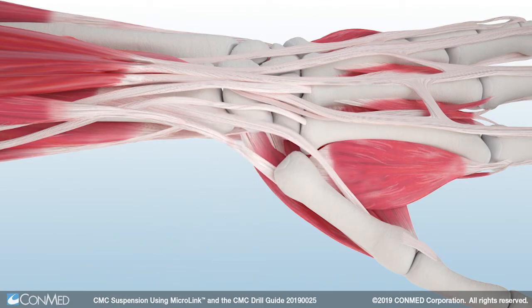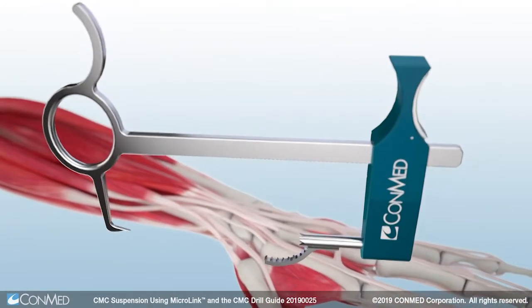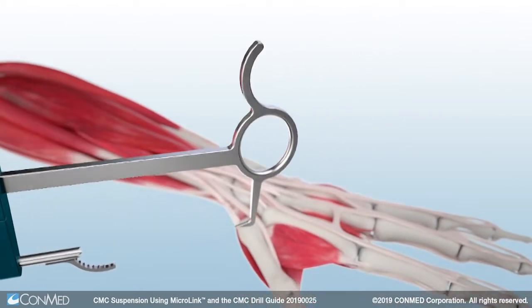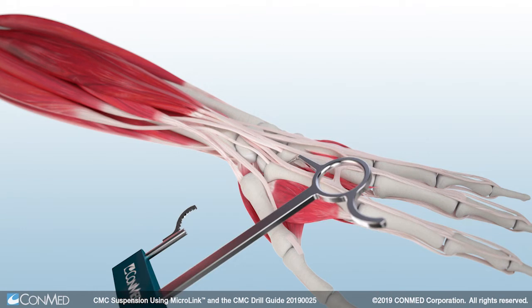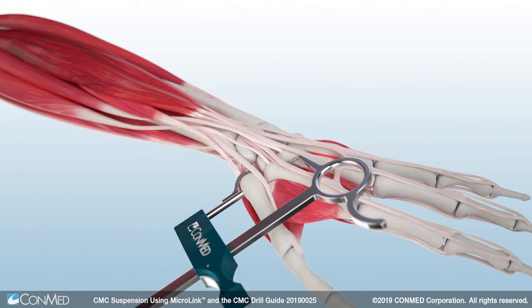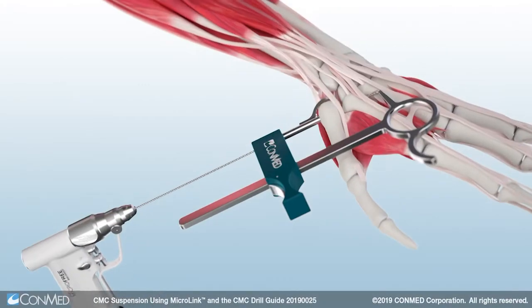The extensor tendon should be reflected ulnarly. Next, the Microlink CMC drill guide is used to assist in precise tunnel drilling. The drill guide with paddle can be placed volar to the base of the thumb, with the distal tip of the guide positioned in the metacarpal flare, distal to the middle and index finger articulation. Fluoroscopy can be used to determine correct positioning of the guide.